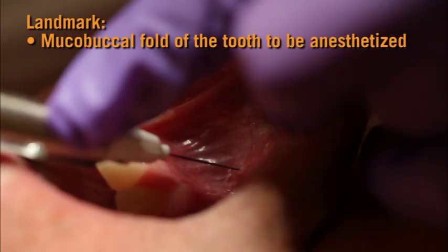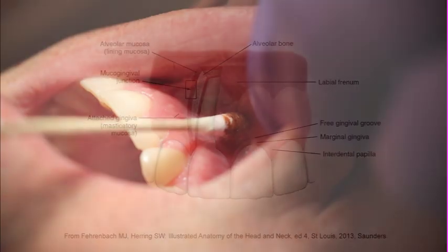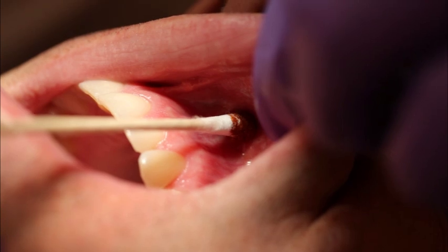The landmark for this injection is the mucobuccal fold of the tooth to be anesthetized. The deposit location or target area for the supraperiosteal injection is the apex of the selected tooth. Because the root lengths of teeth vary among patients, the depth of needle penetration will vary among teeth and among patients. For the maxillary arch, review the average root lengths of maxillary teeth to help make this adjustment of needle depth more accurate. The injection site is the height of the mucobuccal fold at the apex of the tooth to be anesthetized. For this demonstration, we will be anesthetizing tooth number 10.